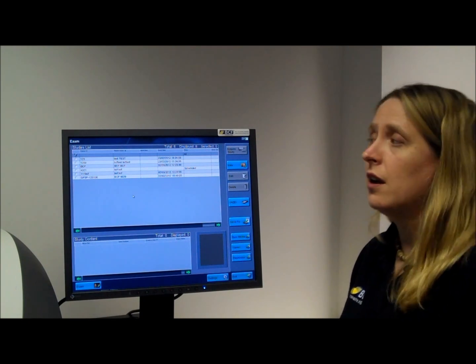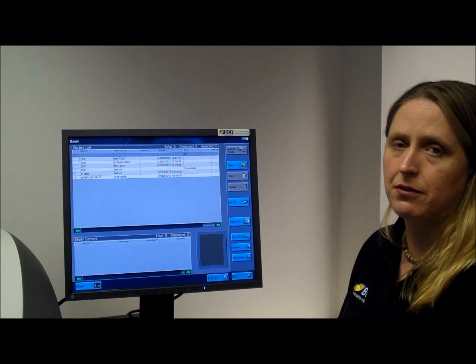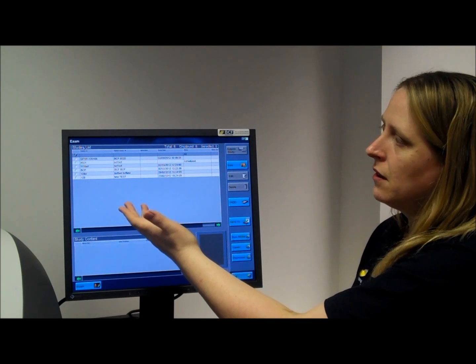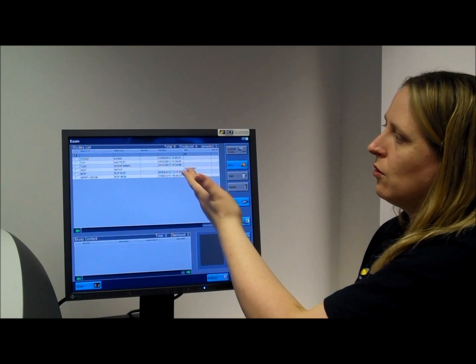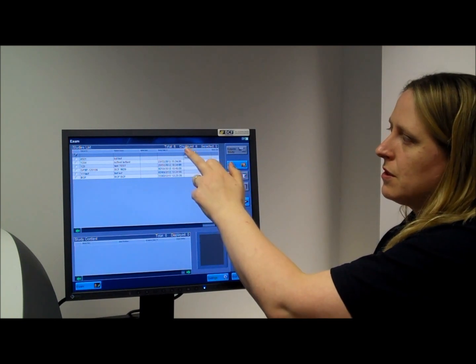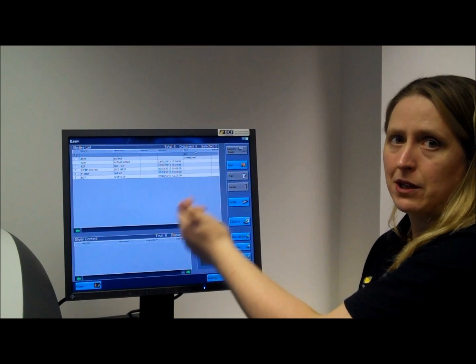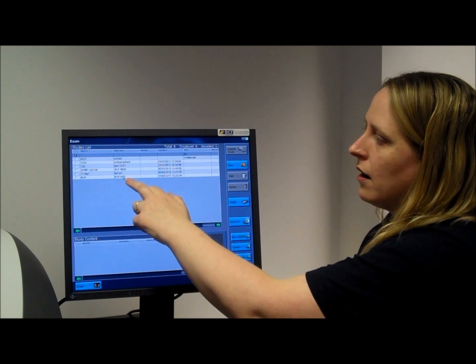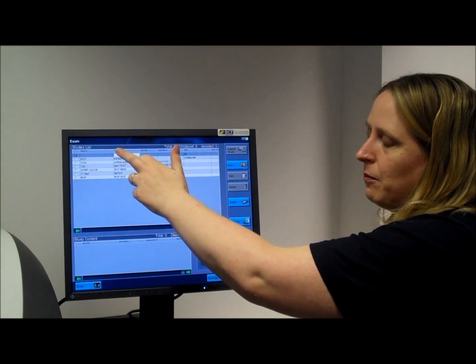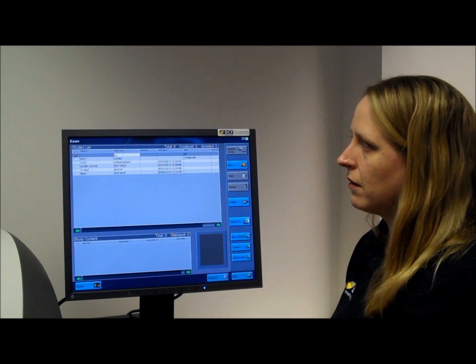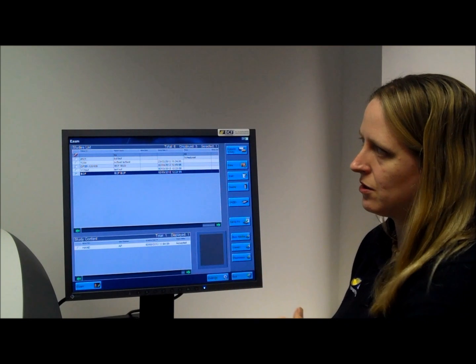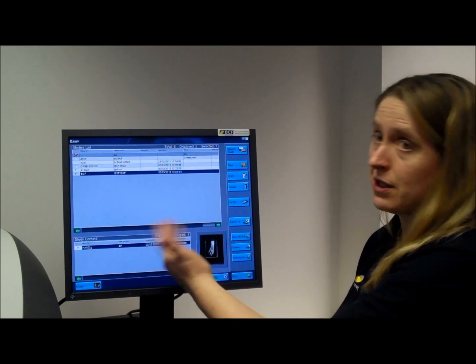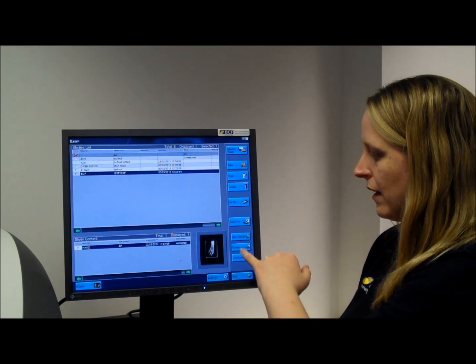If you want to search for a patient, you'll be on the front page, and you've got a couple of different ways of finding your patient. If you click onto a header, it will put the patients into alphabetical order, numerical order, or even by study date order. You can also search by status — scheduled means that your patient doesn't have any pictures yet because you've not actually x-rayed them yet, so don't worry if you think you've lost pictures. To search for my patient BCF-BCF, I'm just clicking below the patient name and start typing, and you can see it's searched down through. Highlight the patient that you want, highlight the pictures that you want — the more pictures you've got, the more you'll see — and you'll see a little thumbnail here, and then you can go straight to the viewer.